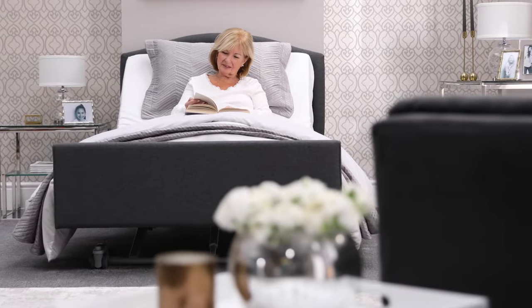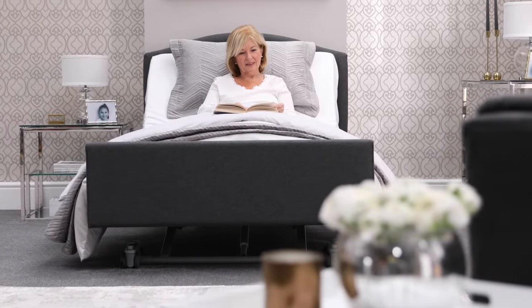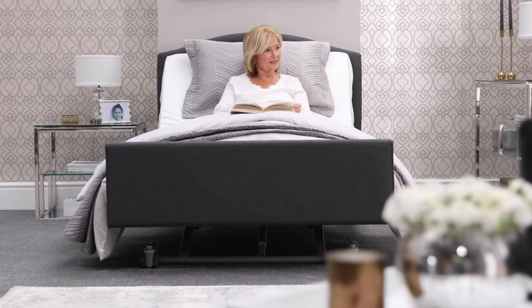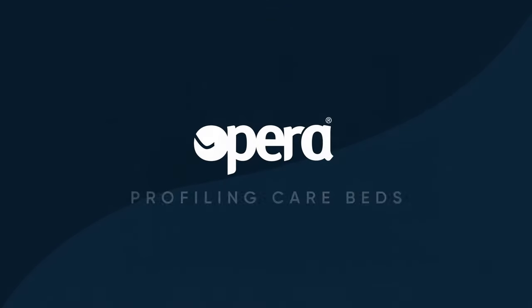Are you looking for a bed to support yourself, a loved one, or residents in your care? Need all the functionality of a care bed but want to maintain a homely, inviting bedroom? Welcome to Opera. You're in the right place.